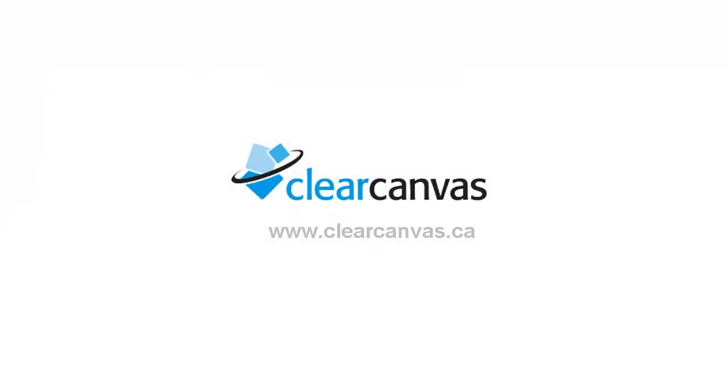That's how easy it is to use PET-CT Fusion with ClearCanvas Workstation. Thank you for listening!